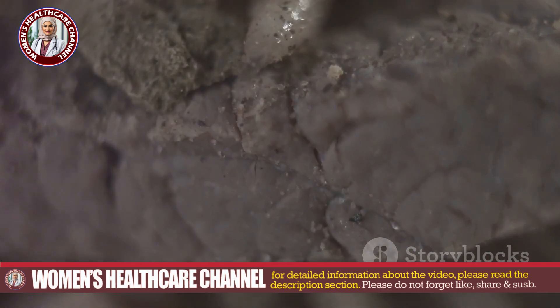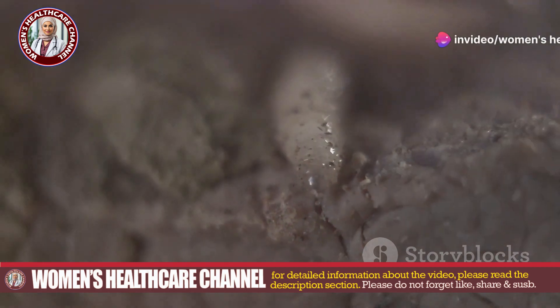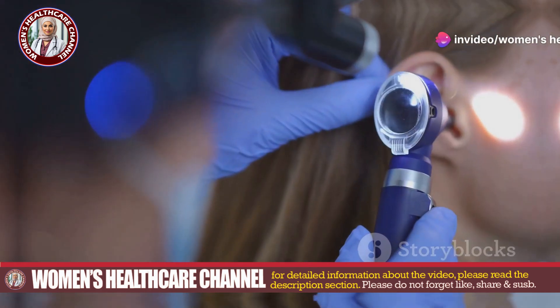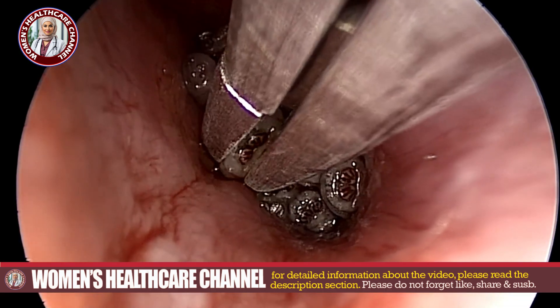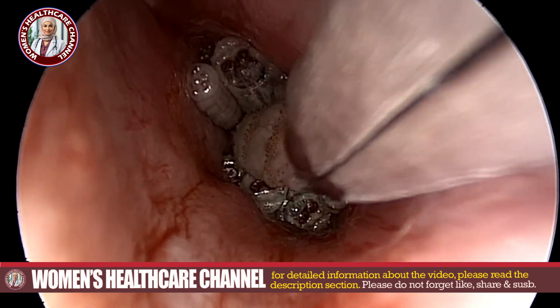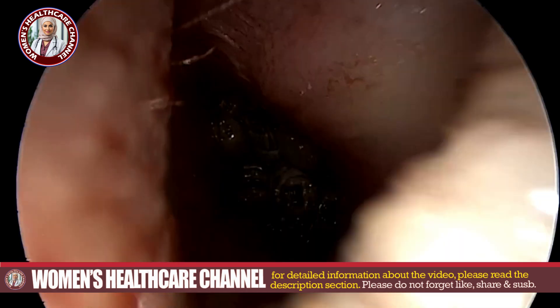Myiasis is an infestation of fly larvae, commonly known as maggots, in the body. This can happen in wounds, skin, or orifices such as the ear canal. The removal of maggots from the ear canal is delicate and should be handled with care to avoid complications.